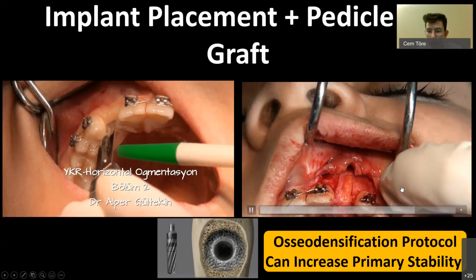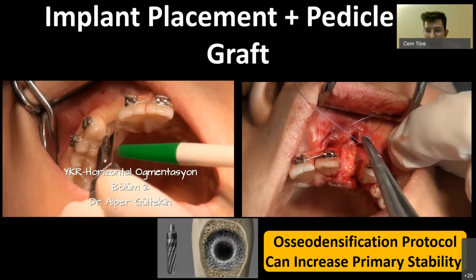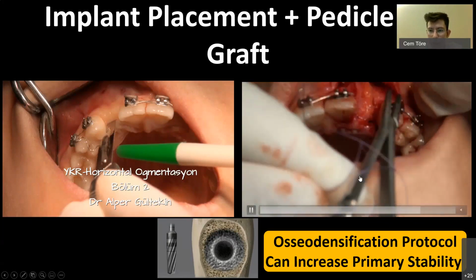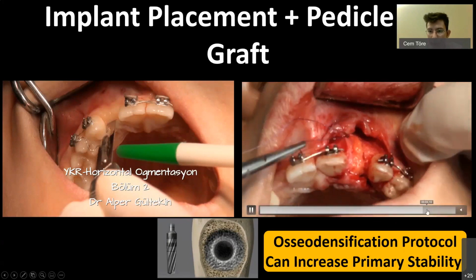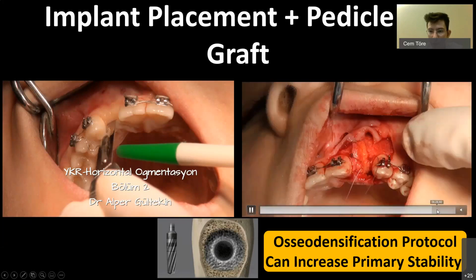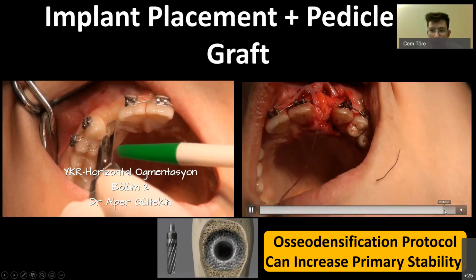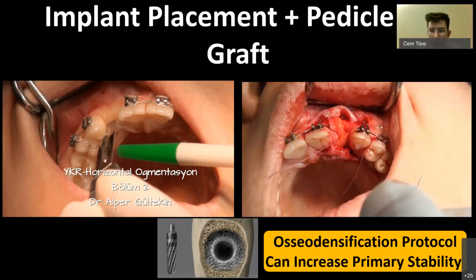Using your resorbable micro suture to lock it in place, once towards the apical parts and once around this tooth here, the canine. Make sure it covers the whole area. Once there, and like we said, once around the canine. And our connective tissue graft is in place and will supply us with the desired thickness in the buccal area.